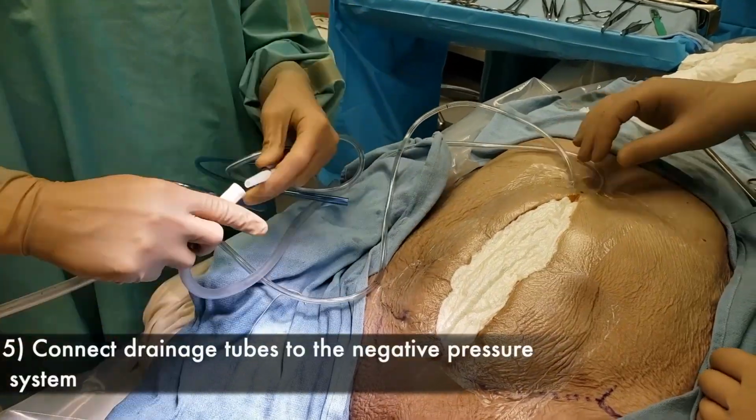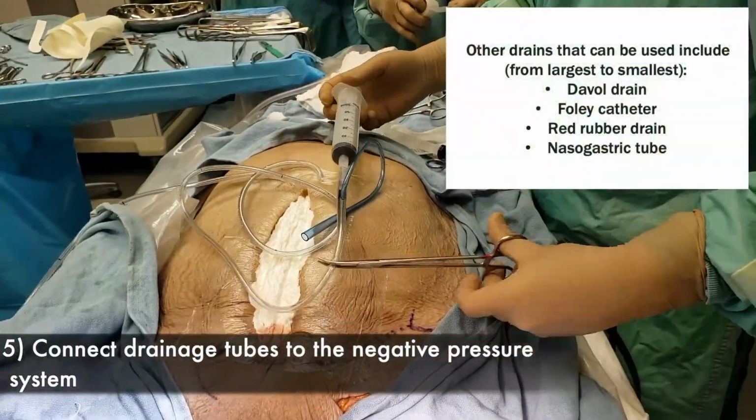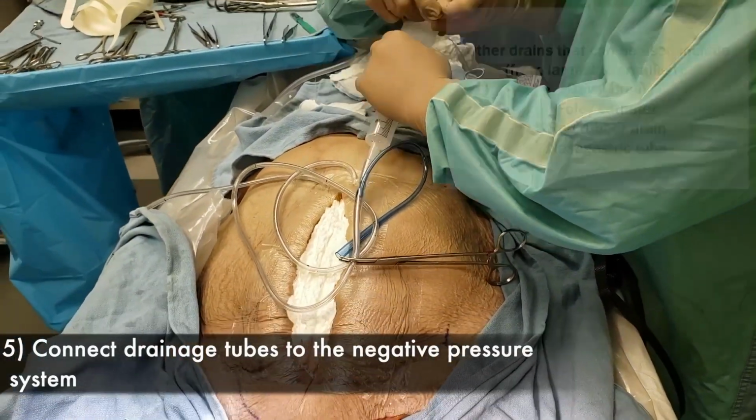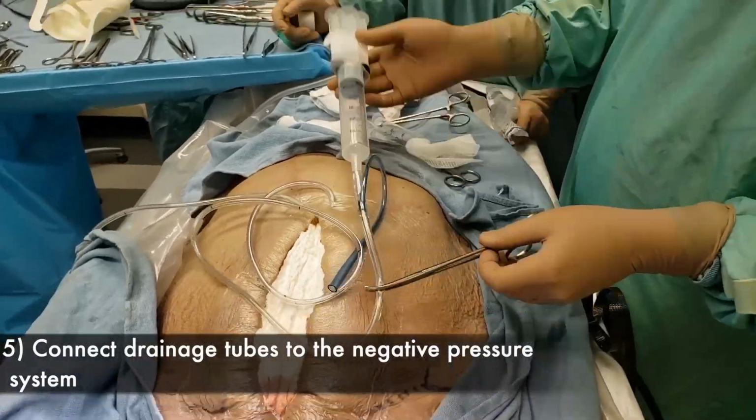Connect each drainage tube to a vacuum. In this video, wall suction and syringes were used as examples of possible vacuum systems. Turn on the vacuum to ensure a negative pressure seal has been successfully created.